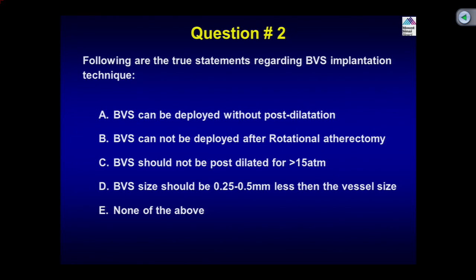Second question, and of course, I have covered that in my presentation. Following are the true statements regarding BVS implantation technique. We have clearly highlighted that the BVS can be deployed without post-dilatation. BVS cannot be deployed after rotational atherectomy. BVS should not be post-dilated to 15 atmospheres. BVS size should be a quarter to half millimeter less than the vessel size.